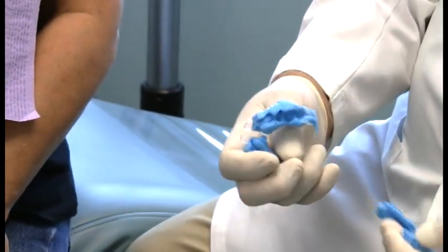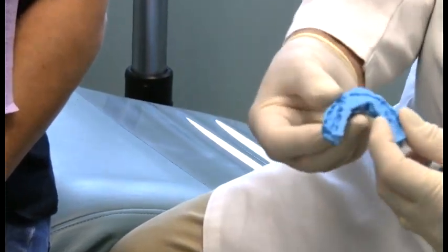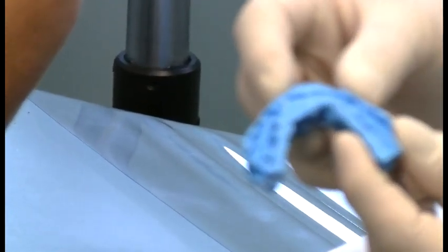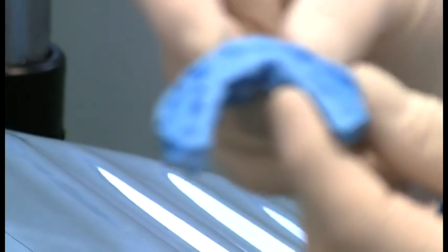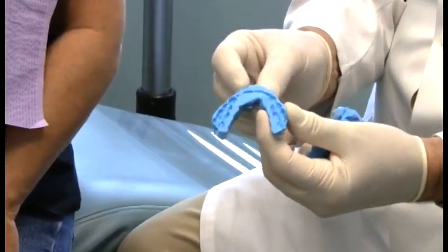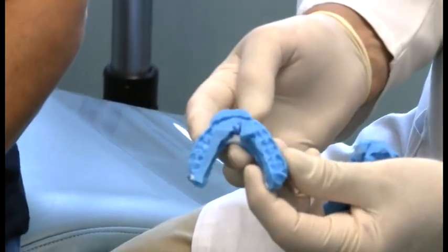and then by looking at the piece of paste that was on here when it came out, that she's on the midline, if you want to provide the lab with a midline, then you can fit the posterior part of this between the teeth, add a little up front, put this back in the mouth, and so in this case when Teresa bites into this, she's going to get a complete bite around the whole arch. So it will show up on both sides.